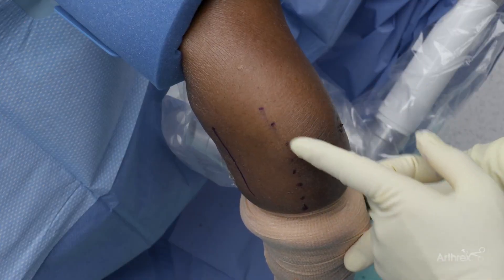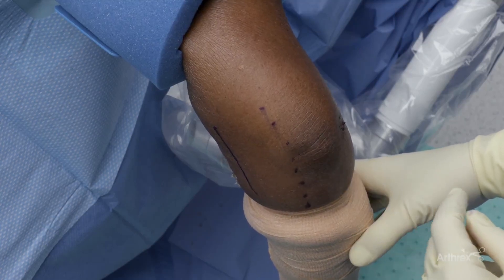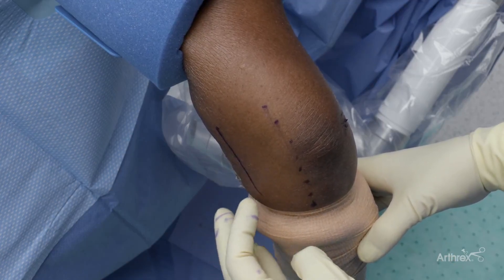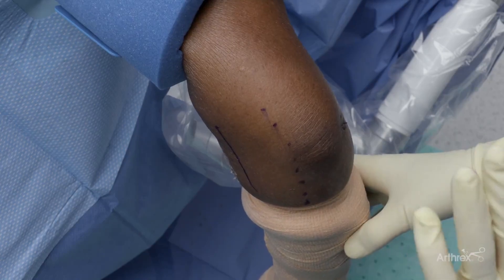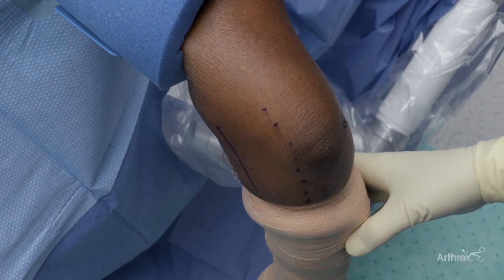On the ulnar side, you have the ulnar nerve, which you have to make sure someone hasn't transposed. And you also have to make sure it doesn't sublux. You also have the median nerve and brachial artery. So we want to try to avoid those areas by having a lateral position, elbow flexed, and we're going to add fluid to the joint to distend it. It adds to the great safety of the procedure.